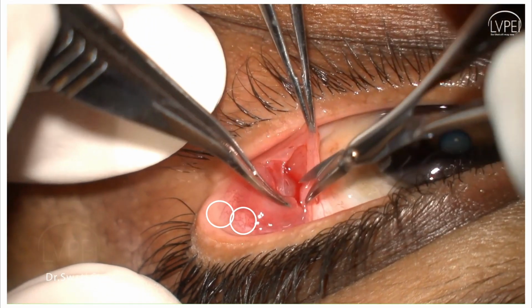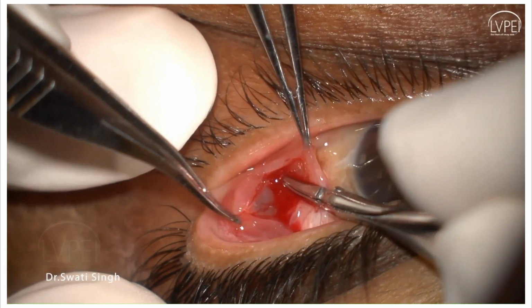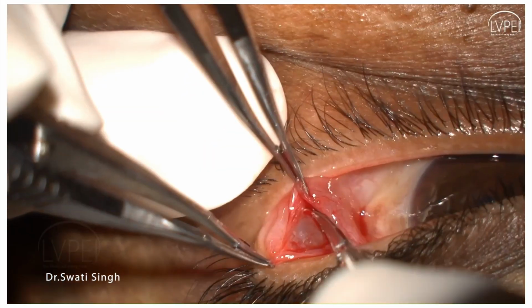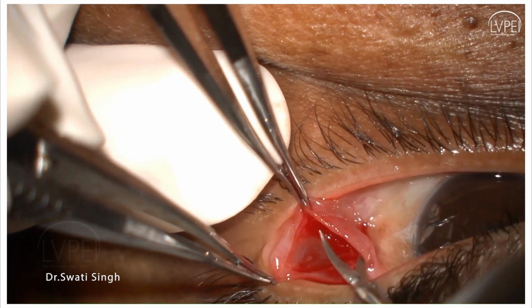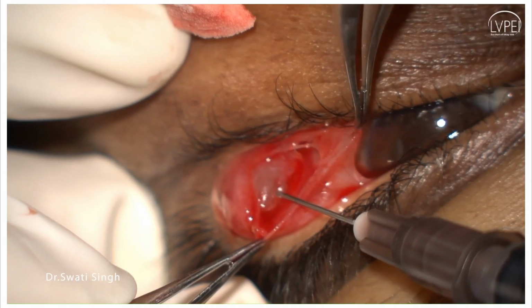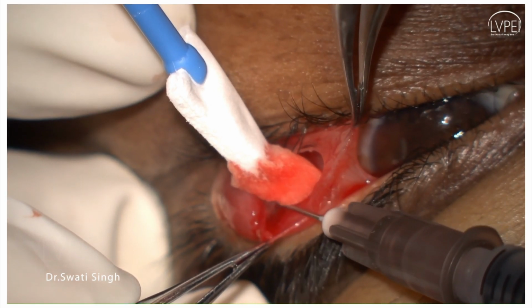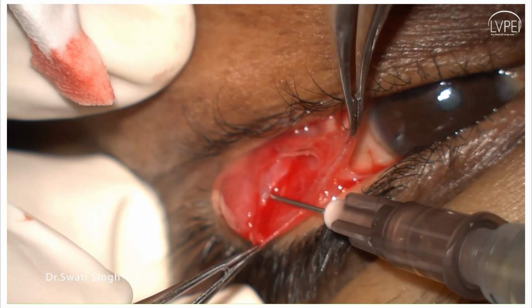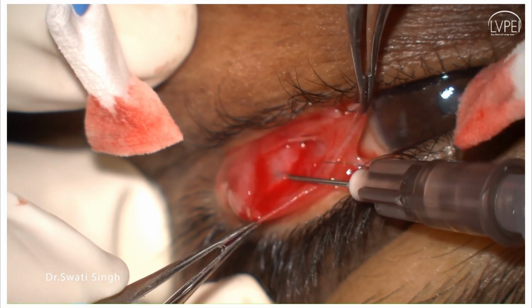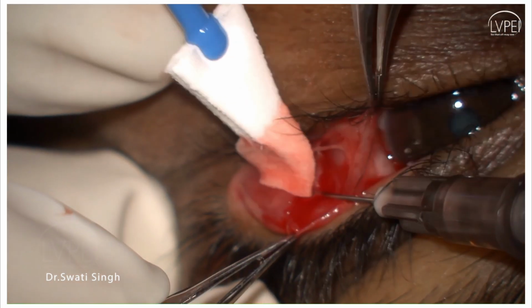Thus, the conjunctiva overlying the cyst is incised inferiorly to avoid damage to the lacrimal gland ductules present superior to the Dacryops. The cyst is separated from surrounding tissue and is now being decompressed by aspiration of its contents using a 27-gauge needle and a 1 ml syringe.